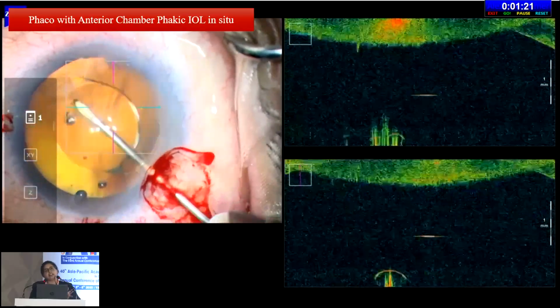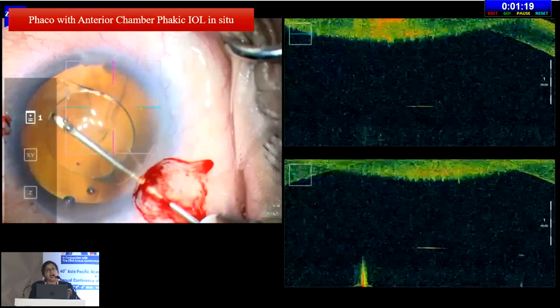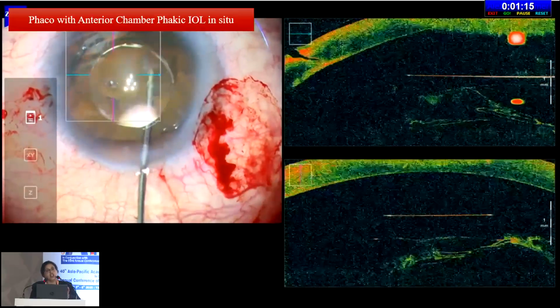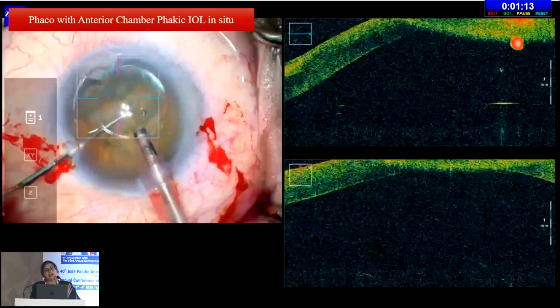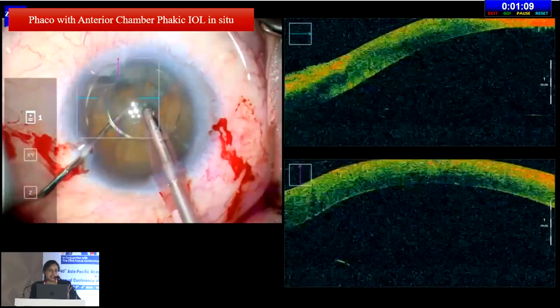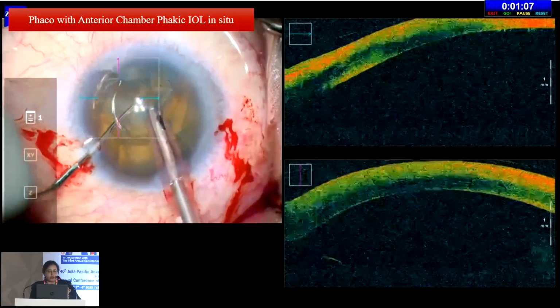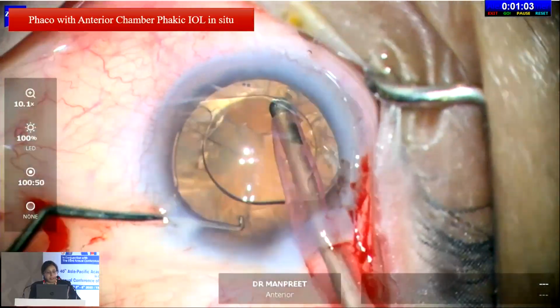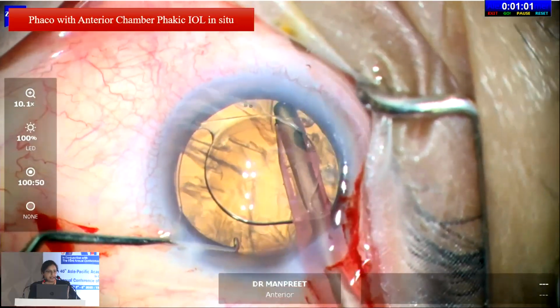This obviates the need for 2 separate incisions. Otherwise, if you explant it first, you are making a 5.5 incision. You have to suture it and either go via a separate incision to complete the phaco or do an ECCE SICS. If you want to do a phaco and preserve a closed chamber phacoemulsification, then beneath a rigid phakic IOL is the way to go.